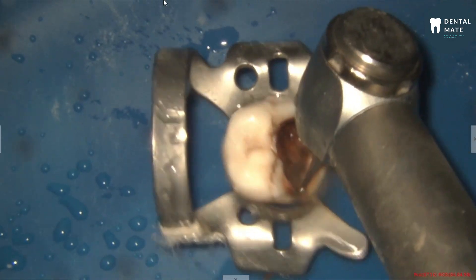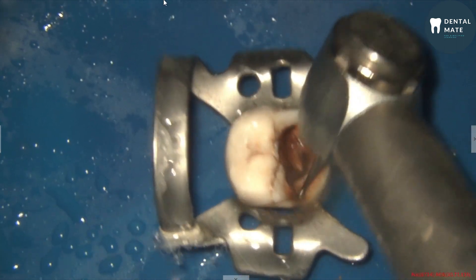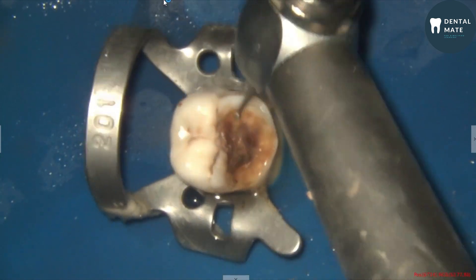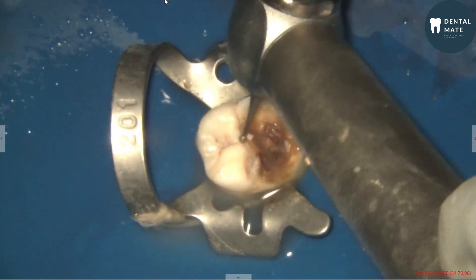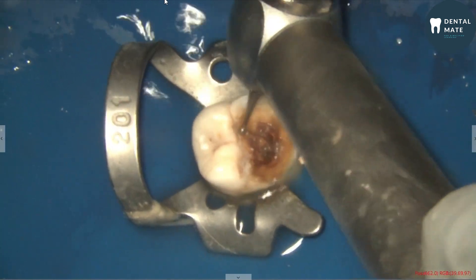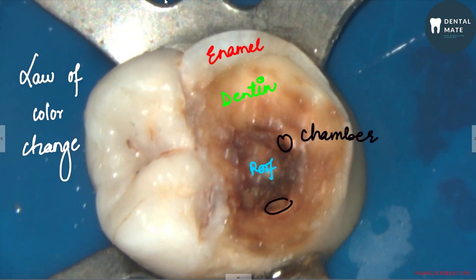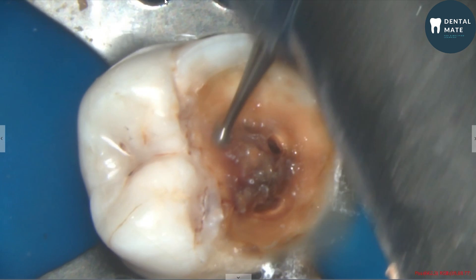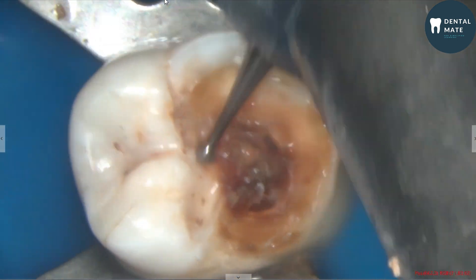We'll start the access cavity preparation with this mandibular molar, trying to make a conservative cavity preserving the soffit and locating all the canals. We'll start with a small round bur, running from periphery to center — first removing all caries from the periphery, then approaching toward the center. Before starting, we infiltrate local anesthesia followed by rubber dam placement. Here I'm removing all the caries from the periphery. We can see the law of color change: enamel is the lightest in color, followed by dentine, and the chamber is darkest in color.